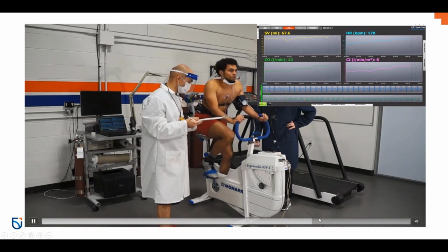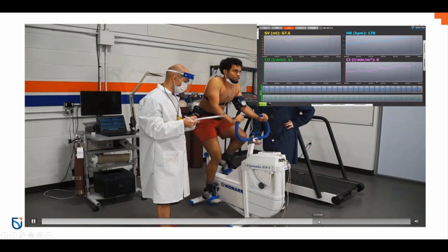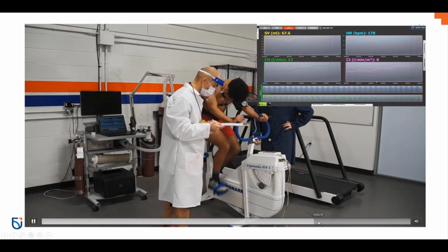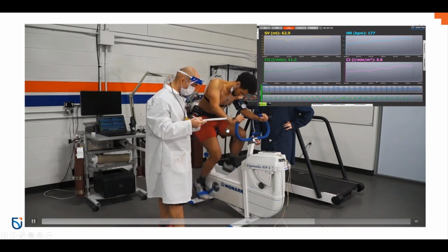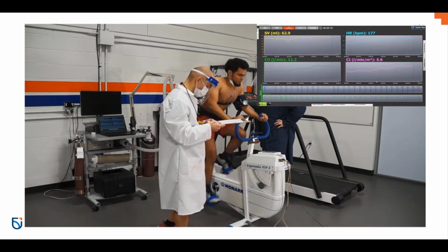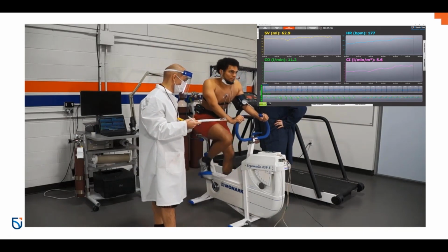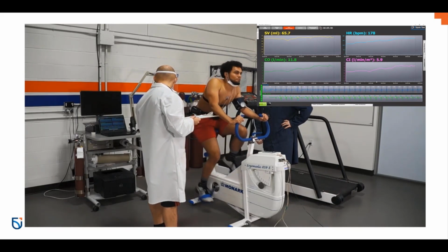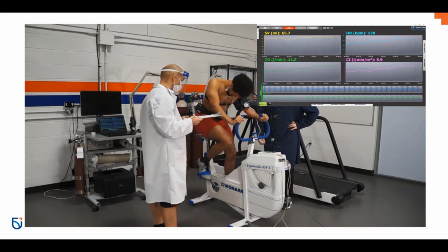As we fast forward in the test a little bit, now we're up to 180 watts because I would have increased it into the second workload stage. You can see that Justin is really starting to work. 180 watts is definitely not a light workload. I chose this because he's fairly fit, and although he doesn't cycle, I wanted the test to be fairly quick. I didn't want to keep you guys watching a multi-stage test.